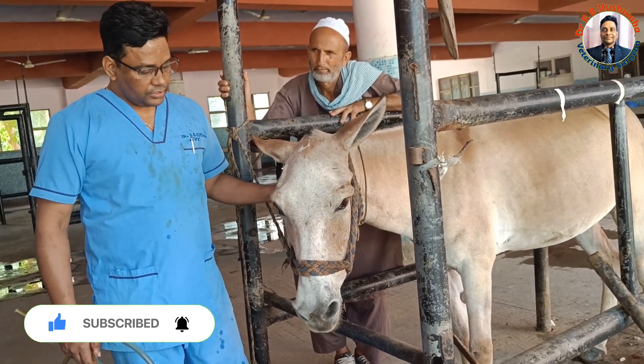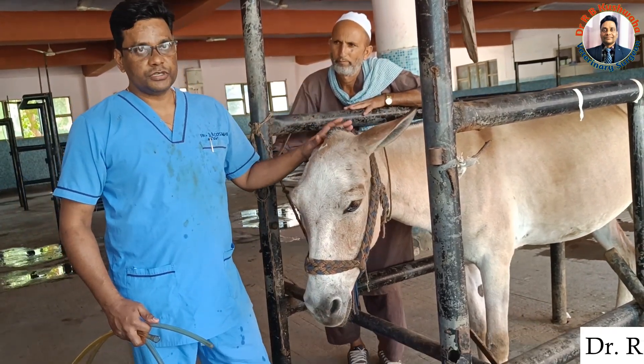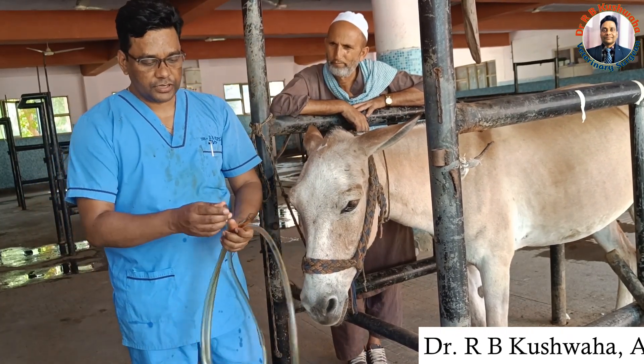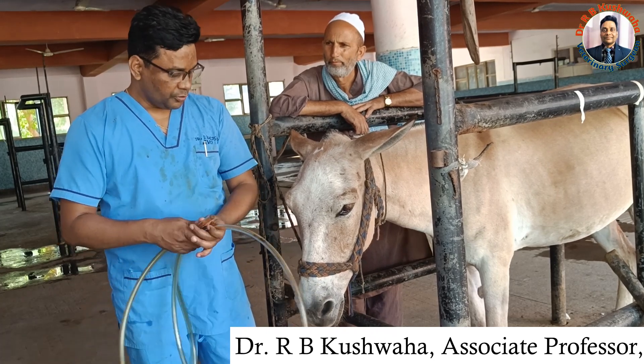Today I am going to demonstrate how to perform naso-gastric intubation in equine. For naso-gastric intubation, we need this flexible tube, and its tip should be rounded so that it does not cause injury to the nasal turbinate or the ethmoid bone.